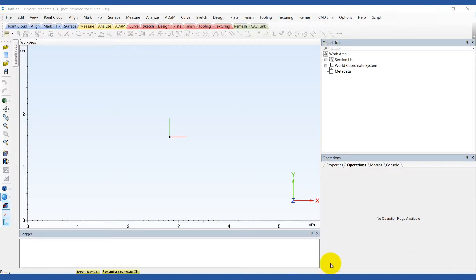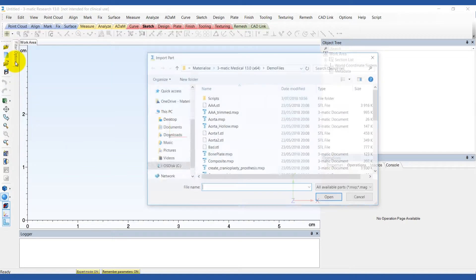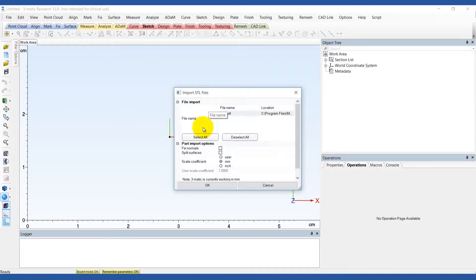The first step is to import the STL file into 3MATIC. We're going to choose the aortic aneurysm from the demo files.